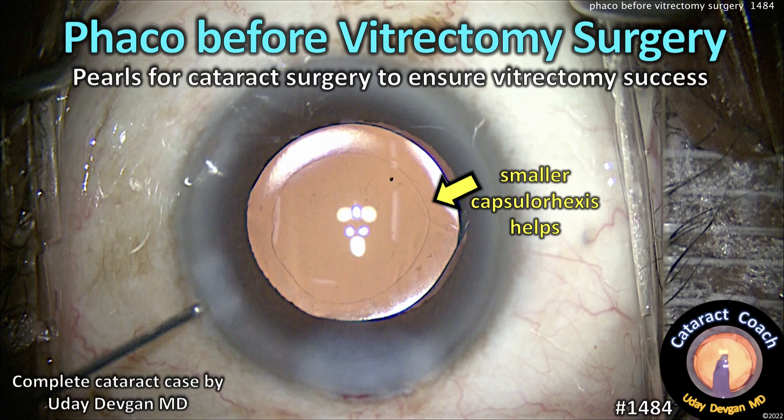CataractCoach.com — phaco before vitrectomy surgery: pearls for cataract surgery to ensure vitrectomy success.